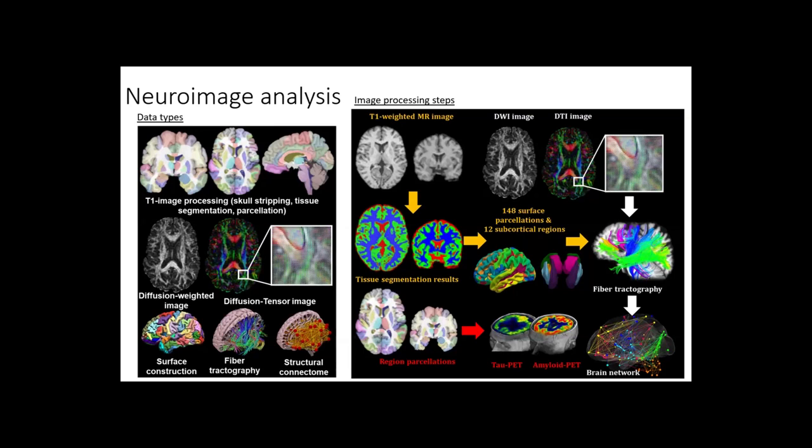From the next lecture, we can study the fibers and really know how two regions are connected. After that, we get the structural connectivity: we know the fibers in the brain and how one region is connected to another, using T1 MRI and DWI. After that, we will have another lecture on how to get functional connectivity. Then we get the graph, and then we do the analysis.